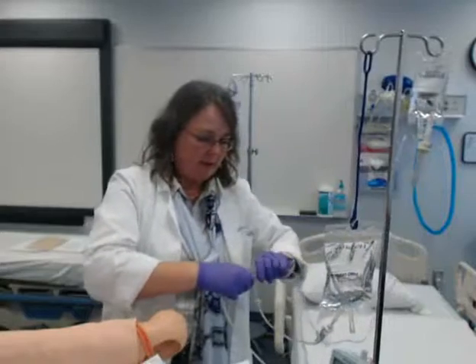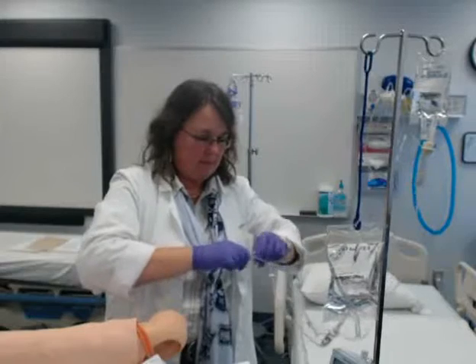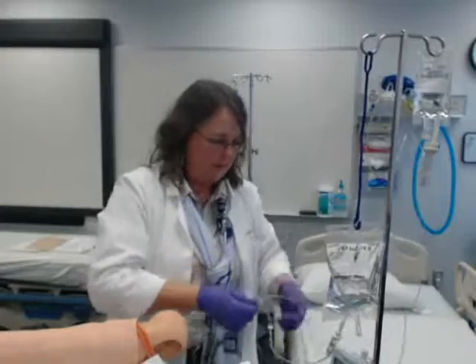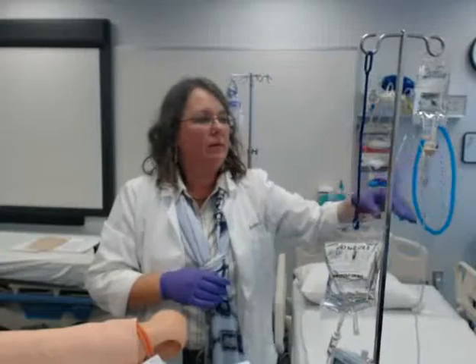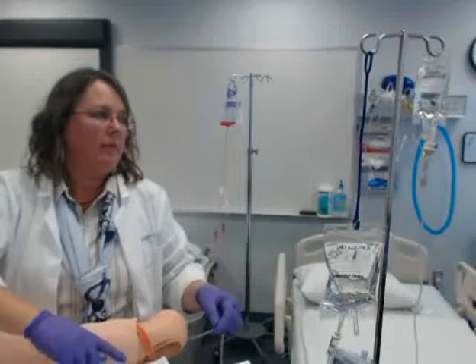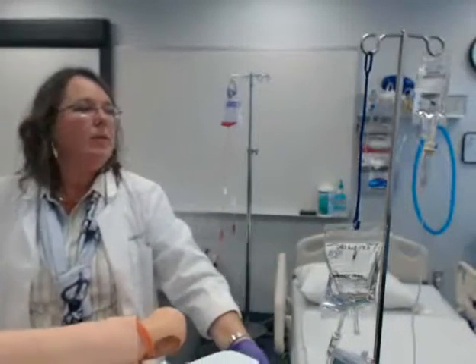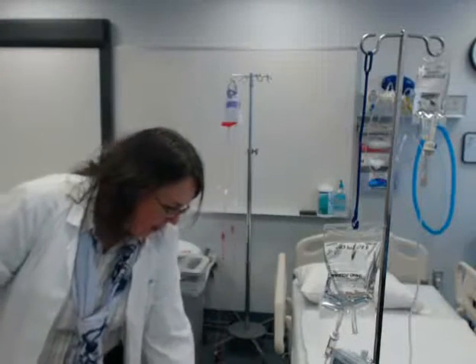Something didn't feel right when I pushed this in here, so I'm going to make sure this is secure. Now it's only partially open, and it's probably also that my arm is high. There we go. I'm going to make sure that it's dripping before I leave.